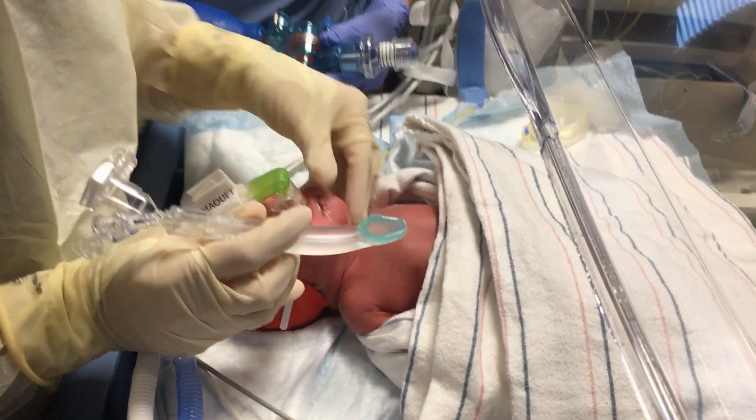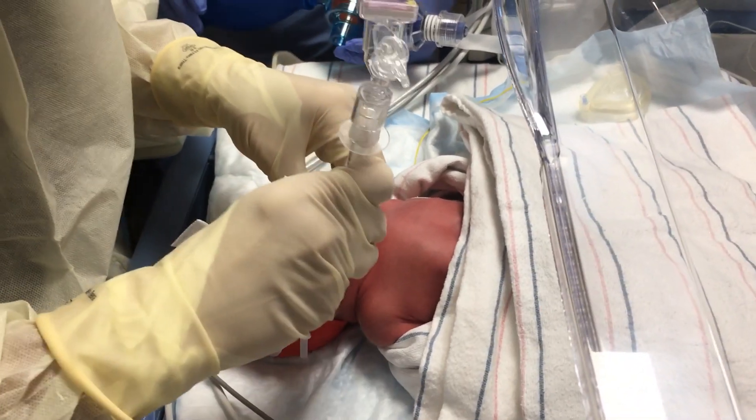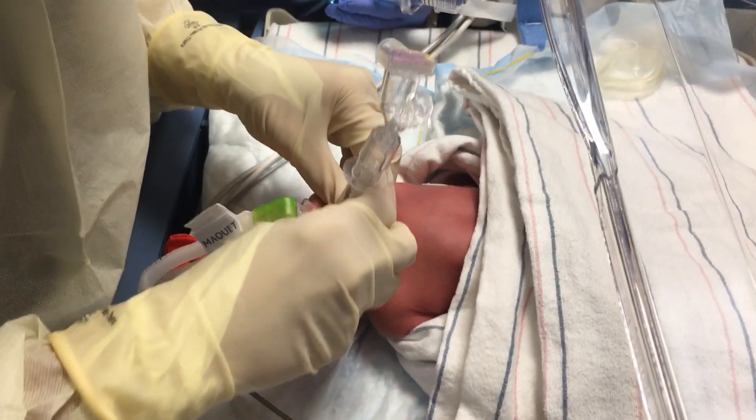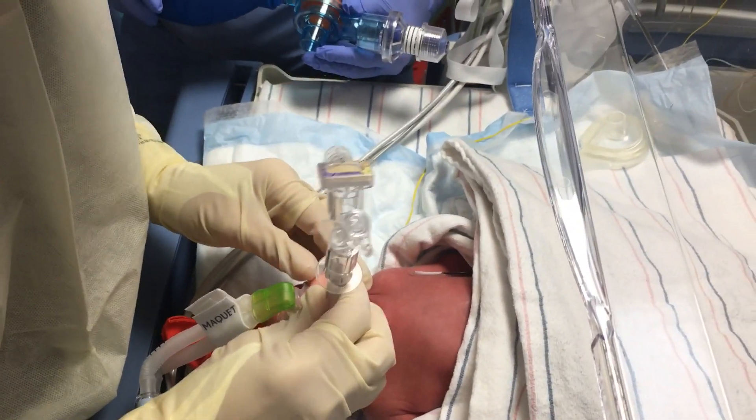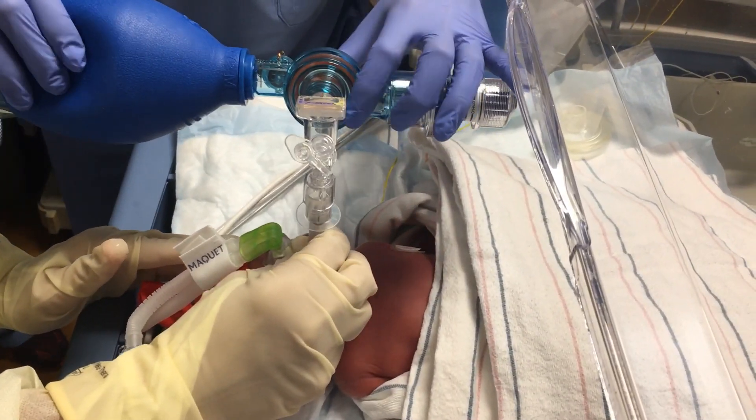All right, will this position the baby? Got a color change. Got a color change. Looks great. Although it's not going... there we go.